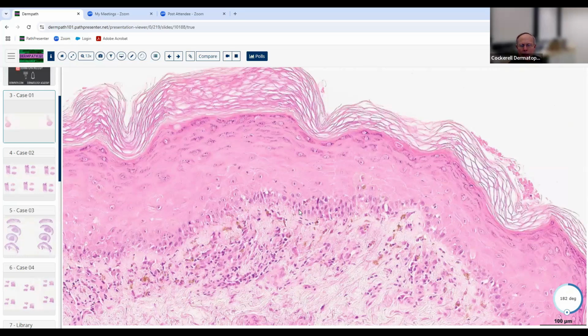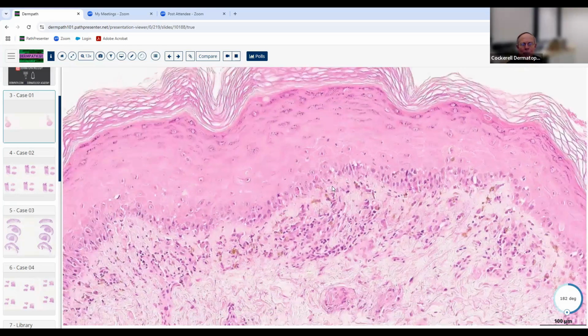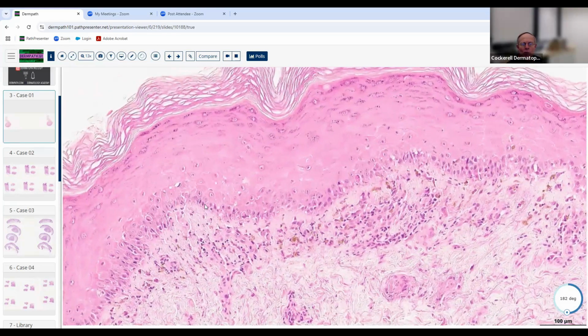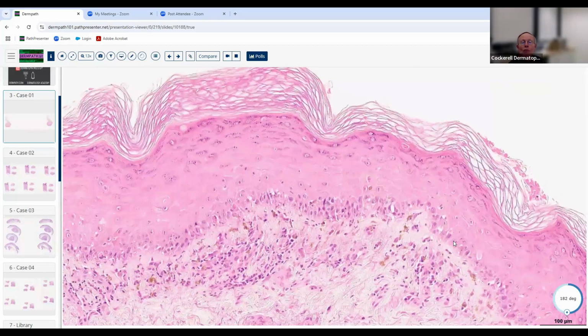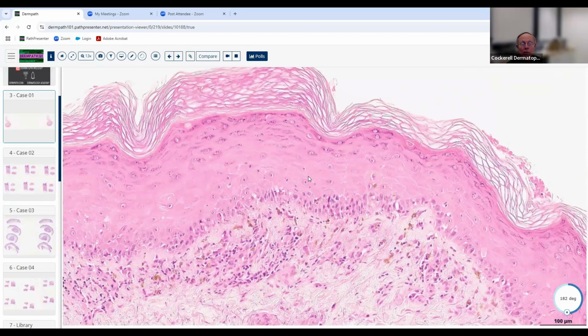So if this were EM, it'd have to be a funny chronic EM, maybe been going on for a long time, which would not fit with this basket weave cornified layer, because we usually think of EM as happening relatively quickly. It's funny that this has a basket weave cornified layer. I think what may be happening here is that this person has had this thing for so long, they've almost developed a symbiosis with their condition, and they're now making relatively normal cornified material, interestingly enough.